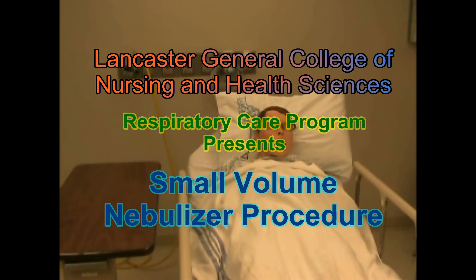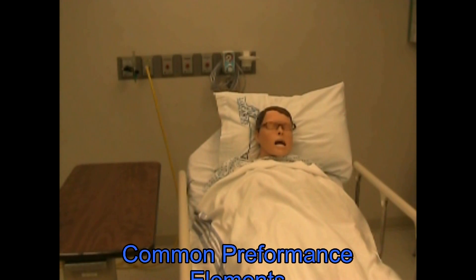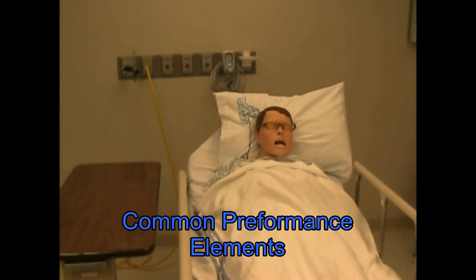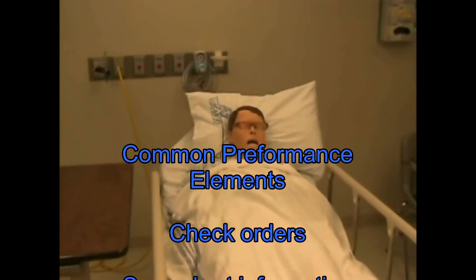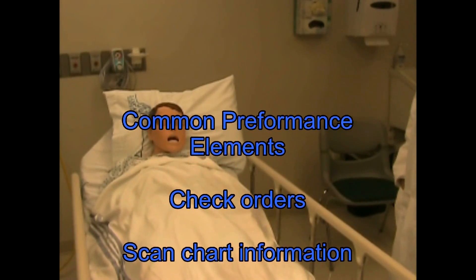This is a procedure for small volume nebulizer. The common performance elements, steps one through eight, will be performed as well as the following.